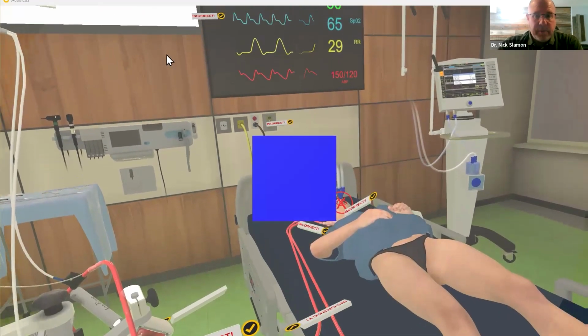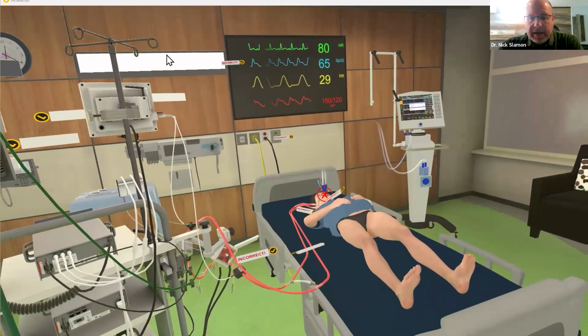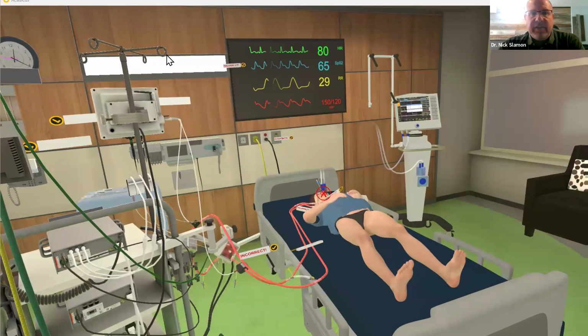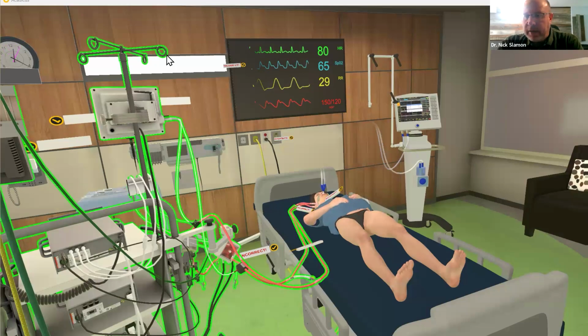We wanted to be able to have the patient bleed, have the patient clot, have air being entrained into the circuit, which is a potentially devastating complication. We wanted to be able to make sure we could change the patient's vital signs by leaning on previous builds of Acadicus. So being able to change from a normal sinus rhythm to an SVT to a VTAC to a VFib, all things that could occur with a really sick ECMO patient and may need you to convert from a VV, just supporting the lung ECMO, to a VA where the lungs and the heart need to be supported.